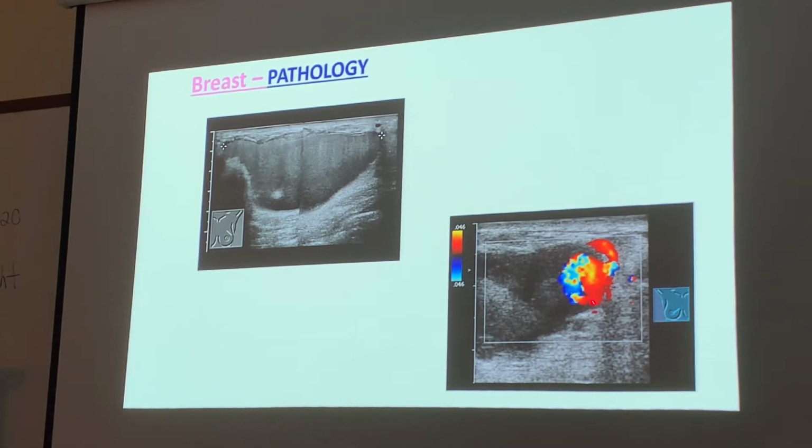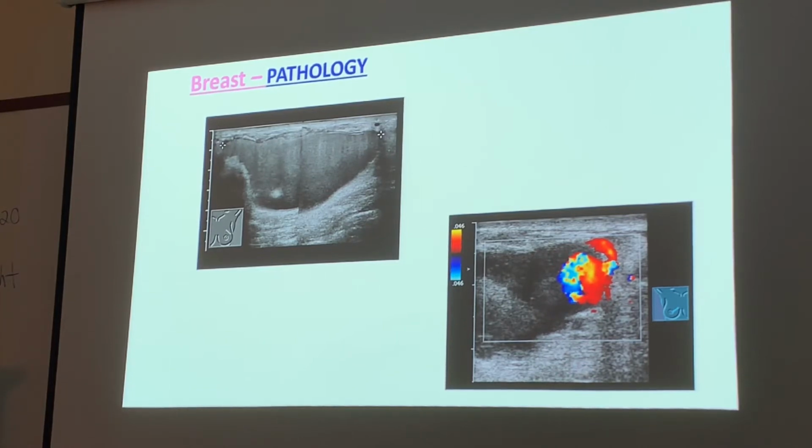This image right here, guys, remember I said after biopsy, you're prone to having a pseudoaneurysm. And this is what a pseudoaneurysm looks like. You're going to have all of these colors mixed up together. I forget what these are.